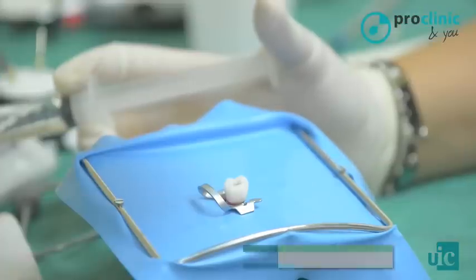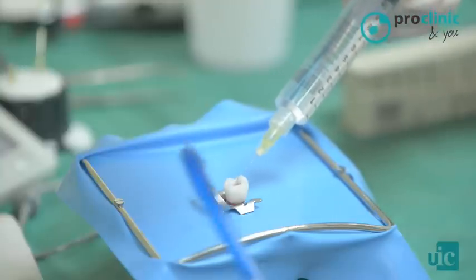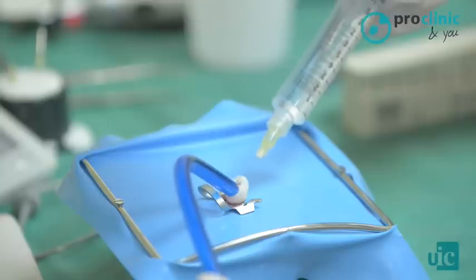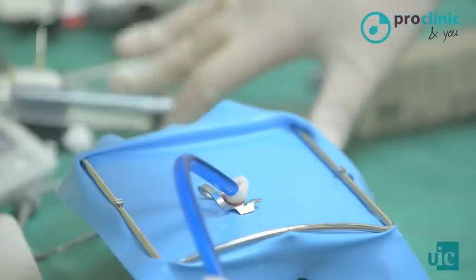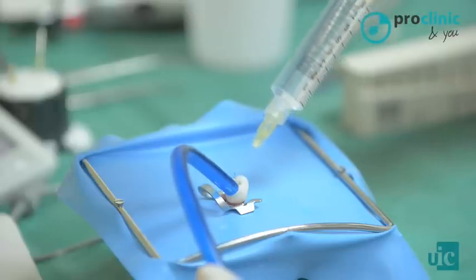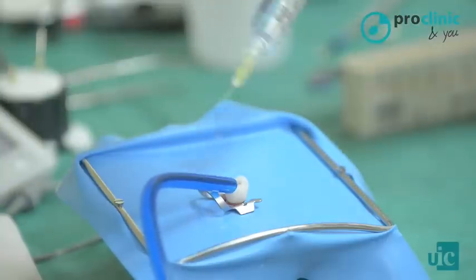Once the instrumentation and the apical calibration are finished, we proceed with the final irrigation. We use root canal irrigants, which are introduced into the canal: sodium hypochlorite, citric acid, and alcohol. We irrigate the root canal for an established period of time, changing the syringe according to the irrigation solution. And finally, we irrigate with alcohol.